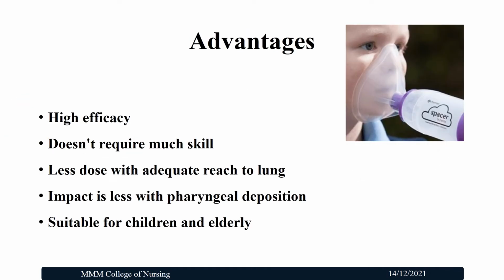By using the spacer, there are many advantages. It is giving high efficacy, and it doesn't require much skill like using the metered dose inhaler directly, and a lower dosage is adequate to reach the lung. The impact is less with oropharyngeal deposition, and it is suitable for children and elderly people.